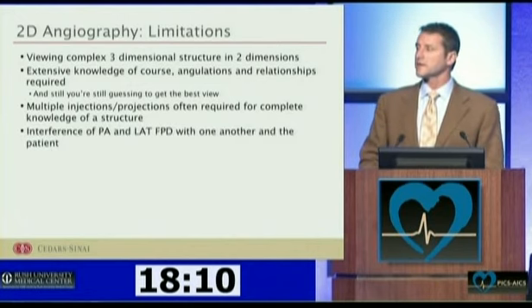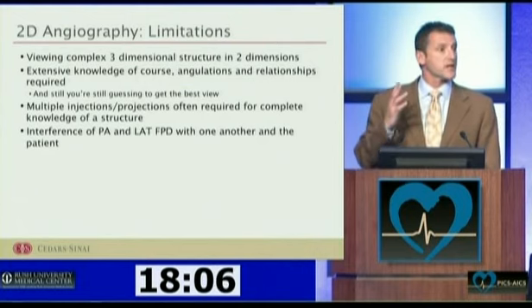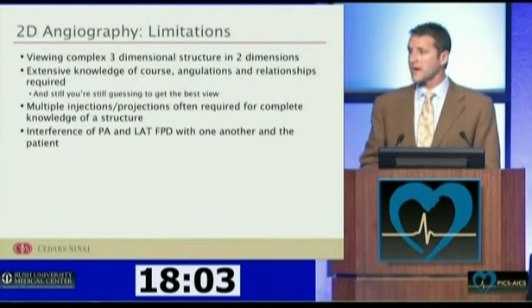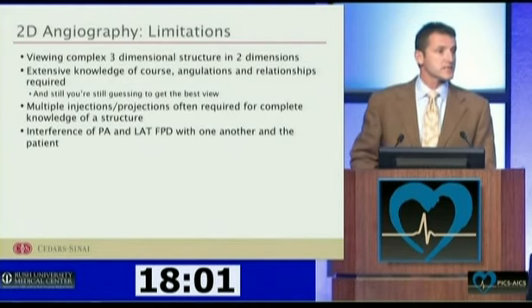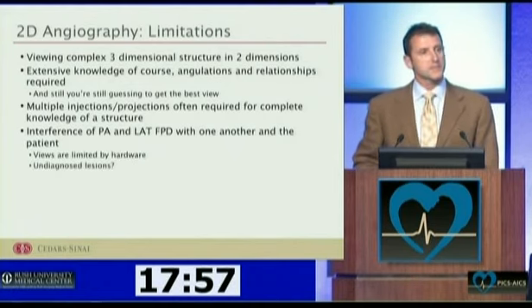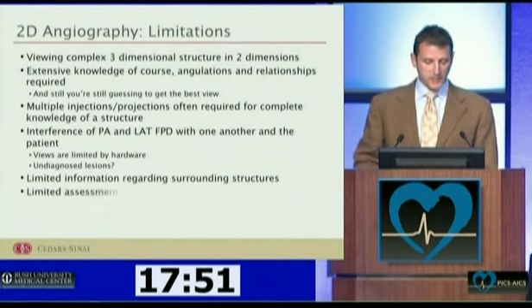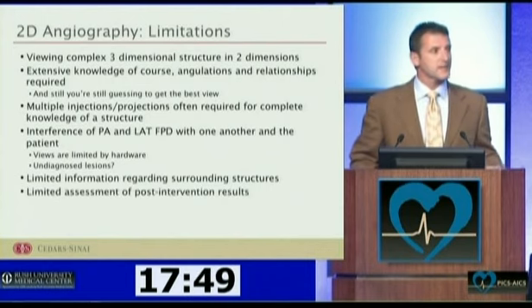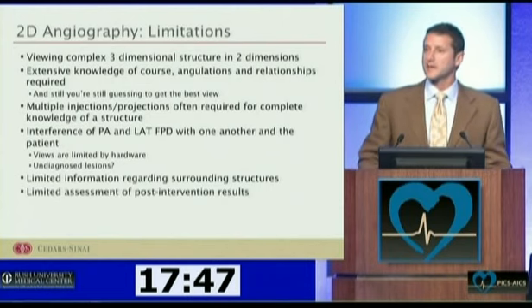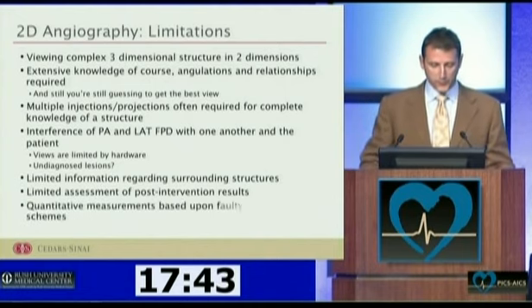There's significant interference with PA and lateral flat panel detectors, not just with one another, but with the patient and the operators and the anesthesiologists and everybody else, which limits you, and perhaps that limitation is having us miss some diagnoses. We get limited or no information, as you've heard so nicely tonight, about surrounding structures, and I think we have a very limited and simplistic way of looking at how our interventions do after we perform them.